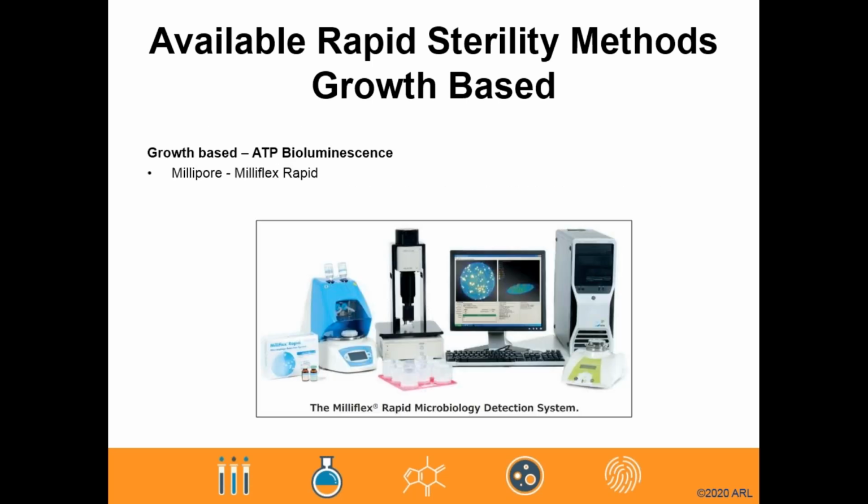One commonly used rapid sterility system which utilizes ATP bioluminescence is the Milliflex Rapid platform. This is from EMD Millipore. Testing using this system entails the filtration of a sample, where then the filter is placed on an appropriate agar medium and then allowed the growth of microbial colonies after that. These colonies are then treated with an ATP releasing agent, followed by the addition of that luciferin and luciferase that I previously mentioned, where photons of light from each colony are then detected by the luminometer and a cell count is reported. With this technique, it is also possible to continue incubation to form larger colonies in case that subsequent microbial identification is deemed necessary.